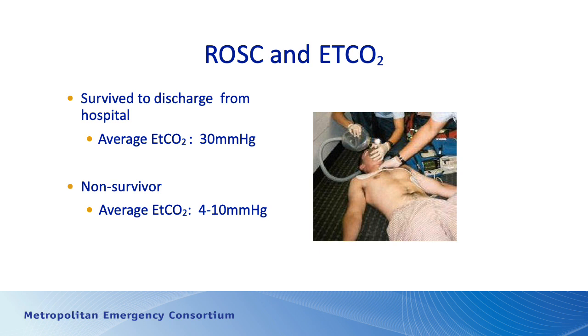So that's why we tend to use end-tidal CO2 as part of our decision making process to determine termination of resuscitation. So patients who continue to have low end-tidal CO2s during the course of the resuscitation have very poor outcomes, whereas those who have good end-tidal CO2s during the course of the resuscitation have a much better chance of surviving to hospital discharge.